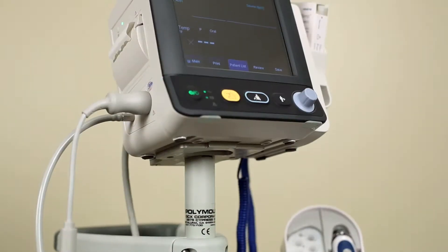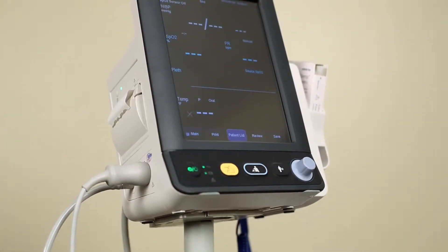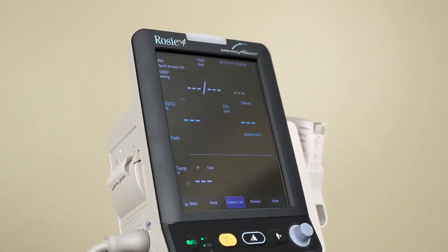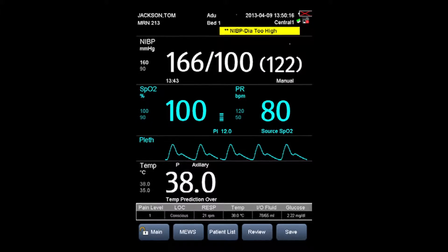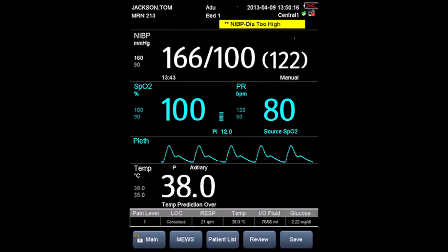Multiple inputs of vitals such as respiration rate, pain level, glucose, fluids, and degree of consciousness.